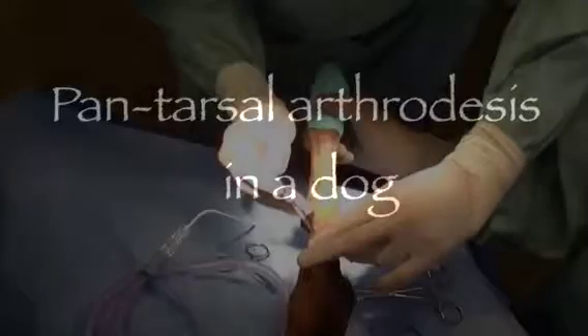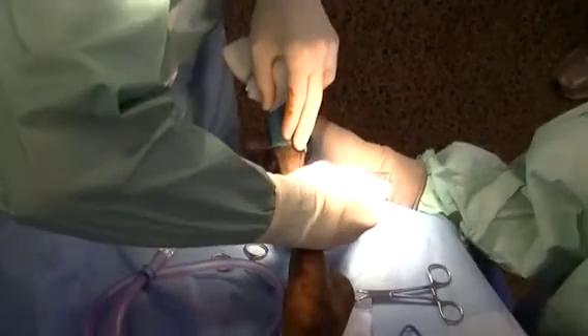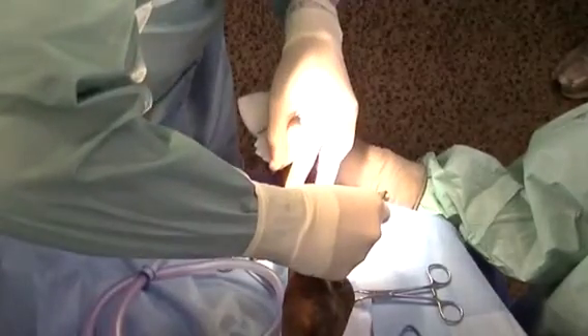Hi, my name is Charles Kuntz, and I'm a surgeon at Southpaws. Today I'm going to talk about performing a pantarsal arthrodesis in a dog who had severe degenerative joint disease in the tibiotarsal joint.